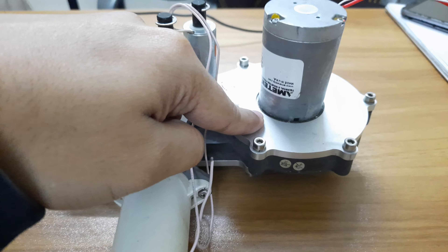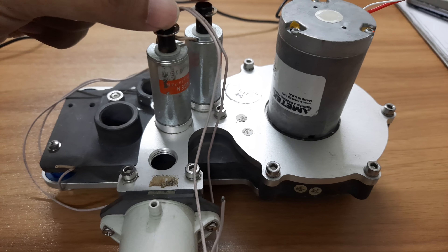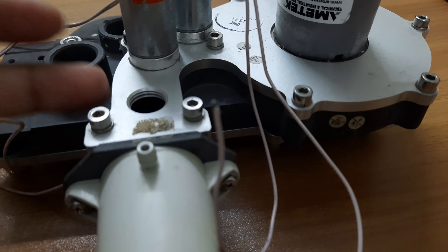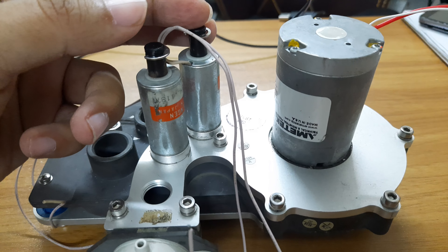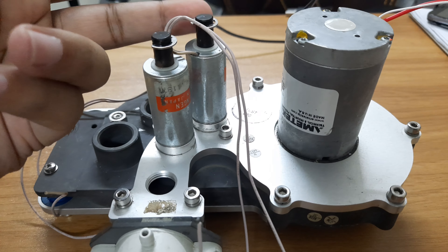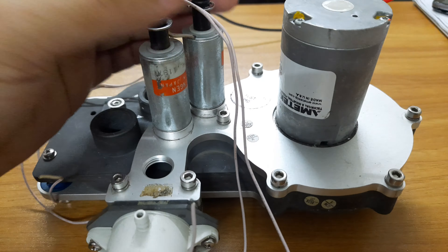For controlling precise pressure, here are two solenoids. How this works: if you apply 12 volts, it goes down, and beneath this mechanism there is a pressure release mechanism. If it presses low, the pressure is released; if high, the pressure goes outside from this outlet, which is the inhalation port.